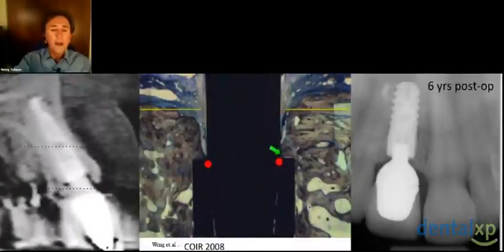But if we are actually able to take a roughened surface or a tissue or bone kind surface onto the abutment itself, and the connection is rigid, we should be able to get, as this specimen shows, even bone integration onto the restorative abutment, at least for a certain distance, maybe half a millimeter or a millimeter, which will even create more stability. And we can follow this with similar parameters today with cone beam CT scans.